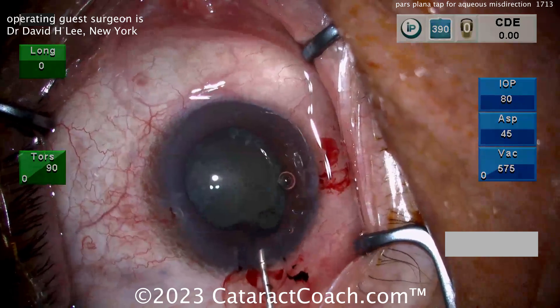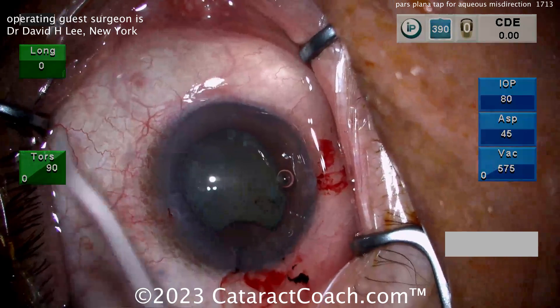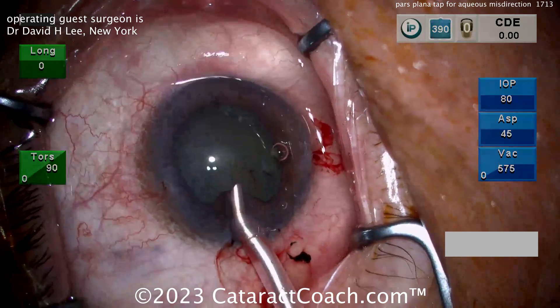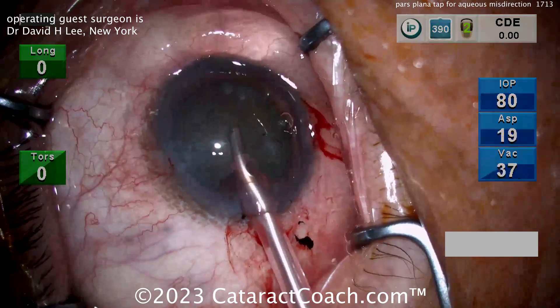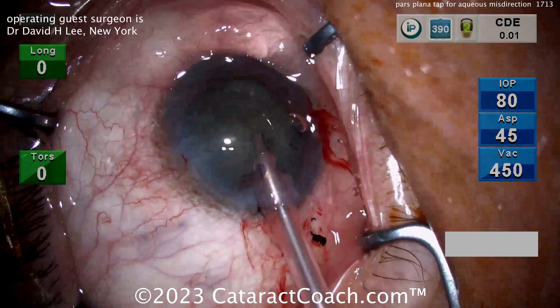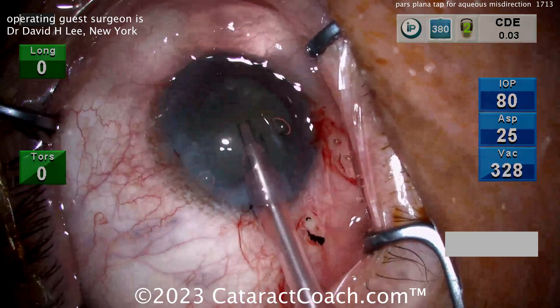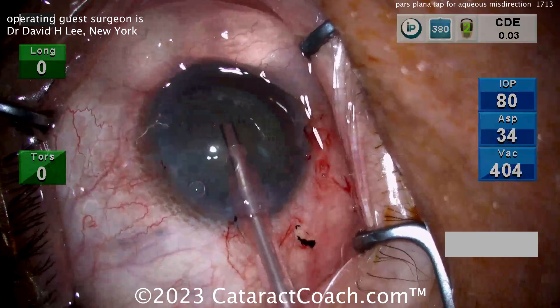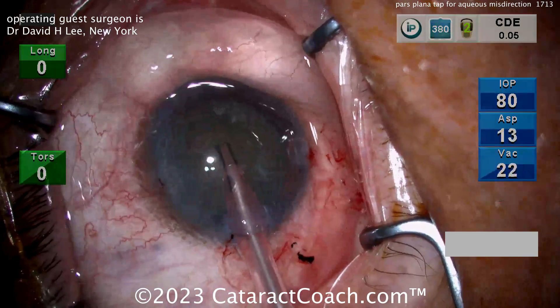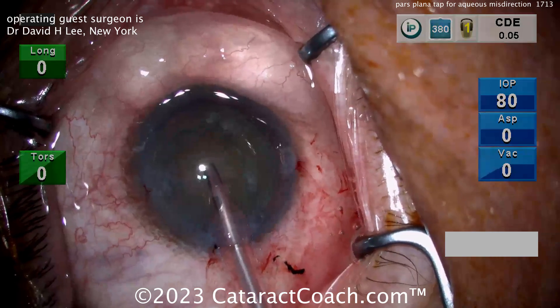That's a really nice outcome. If you ever have a case like this, you definitely need to learn all these techniques. Ask yourself: where is the pressure gradient? Where is the trapped BSS? Like in this case — if it's trapped behind the posterior capsule in Berger's space where the anterior hyaloid face is — use a needle and do a pars plana tap. It will definitely work, and then the rest of the case is pretty routine. Great case — thank you for sharing. I'm sure we all learned a lot.